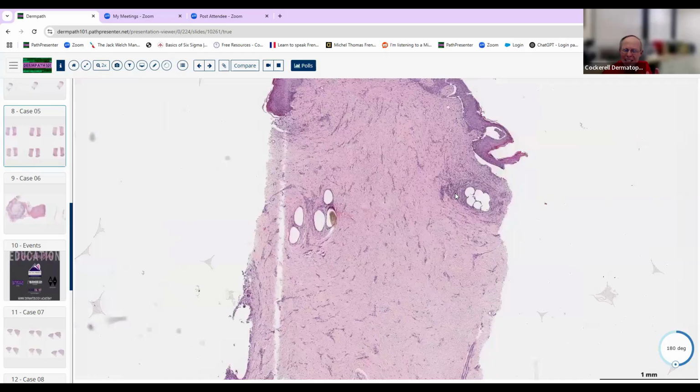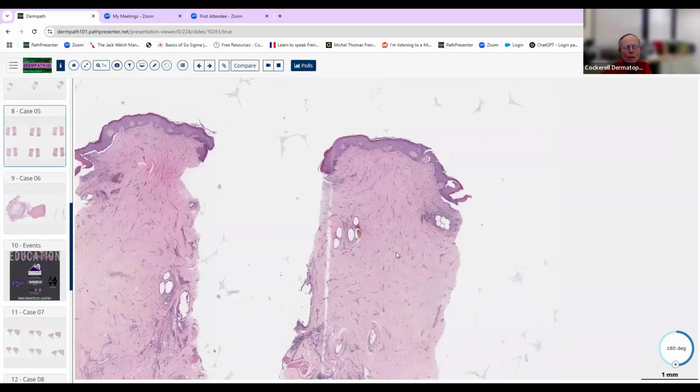That doesn't tend to just stay in the follicle long enough to allow that perifollicular inflammation to develop. It tends to get in the follicle, ruptures, and then it sort of starts marching diffusely. So you don't really tend to get that same type of more slowly developing perifollicular onion skin fibrosis like you see with those other conditions in that process.